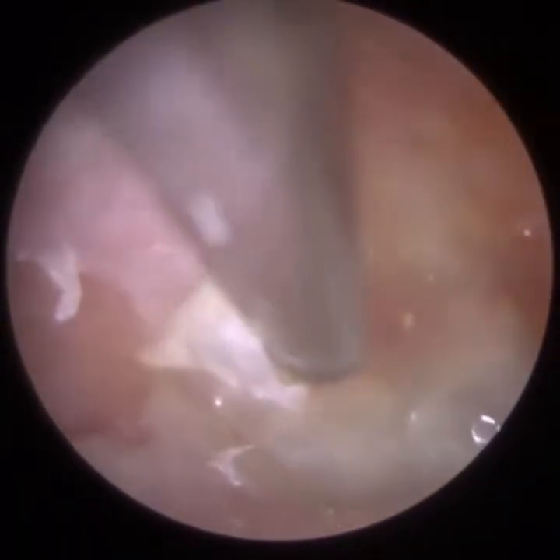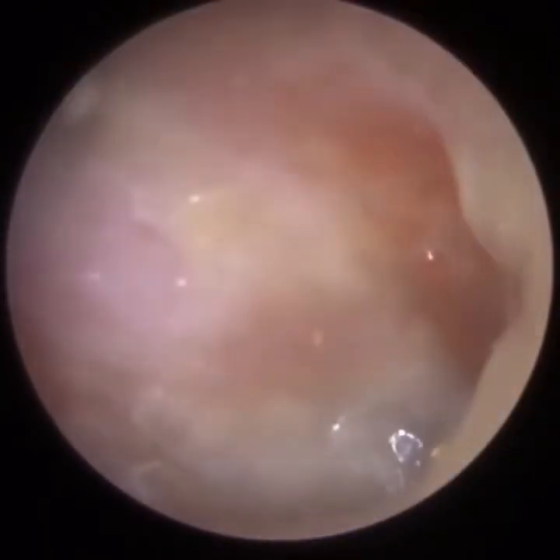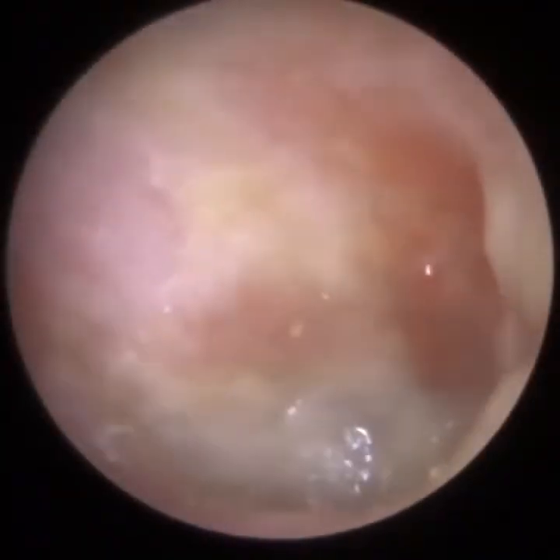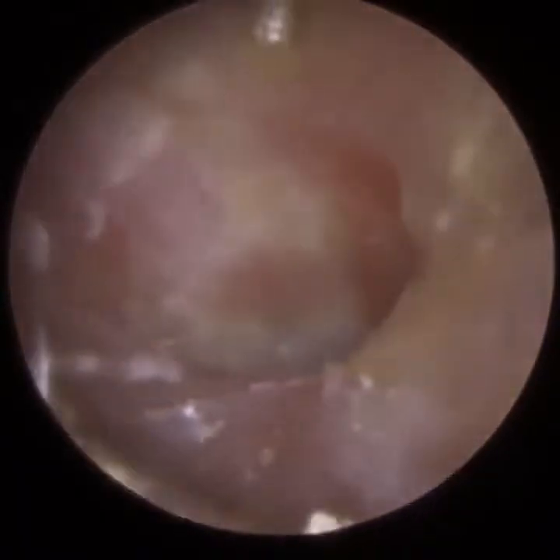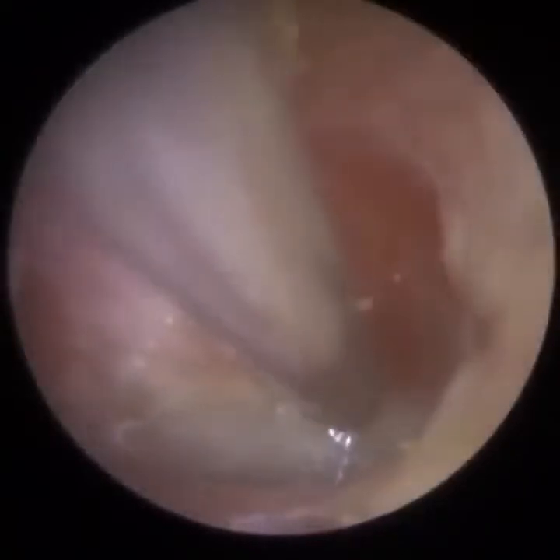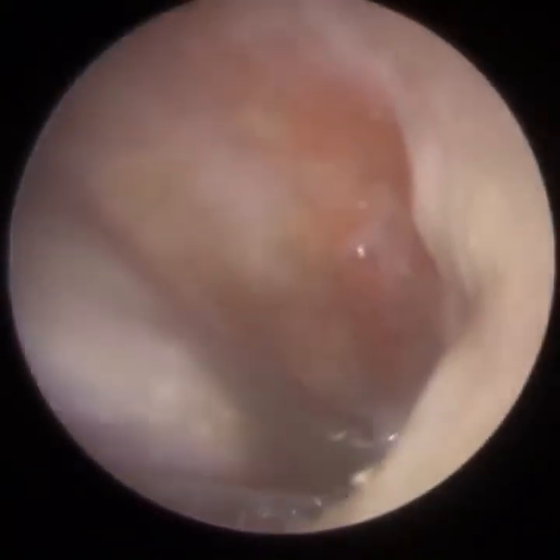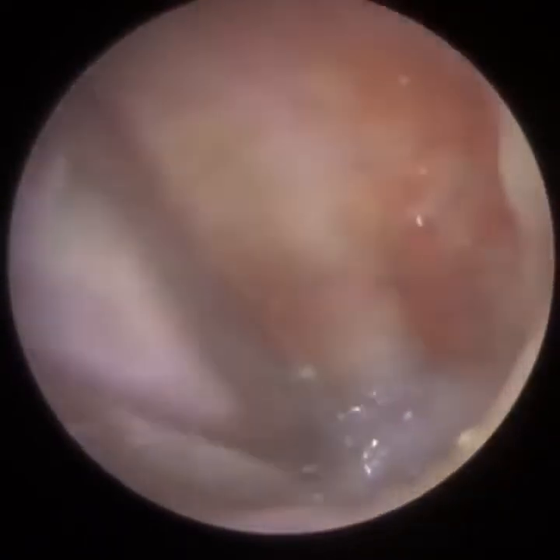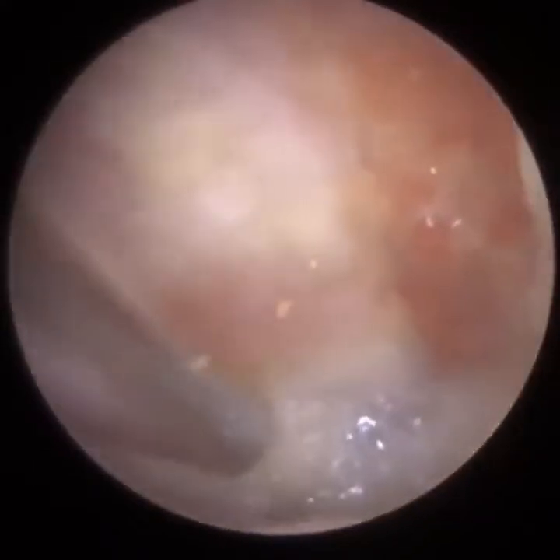So obviously it goes without saying, you need a really steady hand when you're doing this kind of work so close to the eardrum. And a lot of experience, doing this for many, many years now. I'm a lot more confident, experienced, skilled in what I do. Anyone starting off, when we train our clear wax delegates, we're giving them realistic expectations, and it could take years before they can perform procedures like this, if at all. So it's not easy what we do, especially when the patient's awake. There's no anaesthetic that we use.